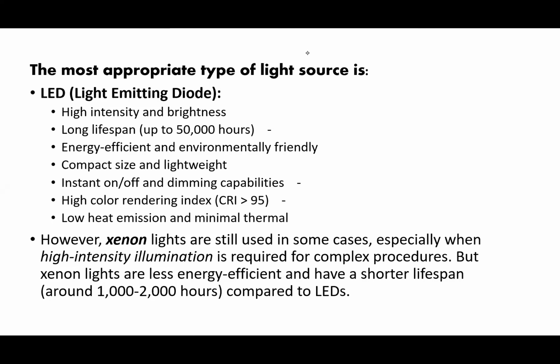Now, however, xenon lights are still used in some cases, especially when high intensity illumination is required for complex procedures. But xenon lights are less energy efficient and have a shorter lifespan. You can see the lifespan as compared to LED of 50,000 hours.